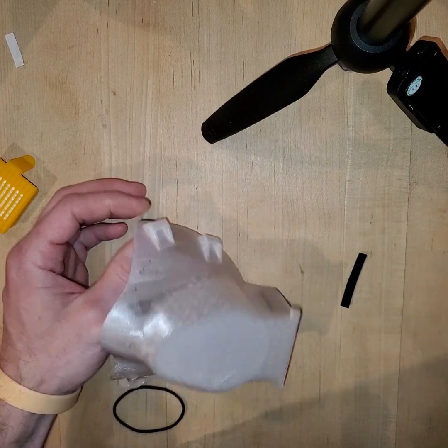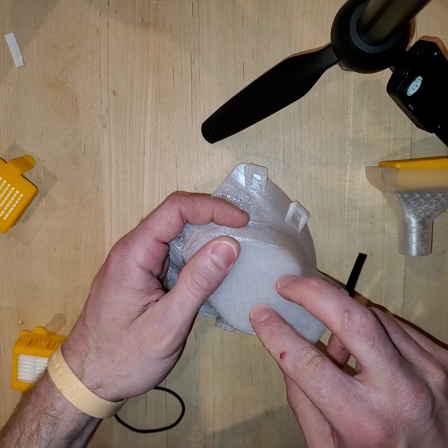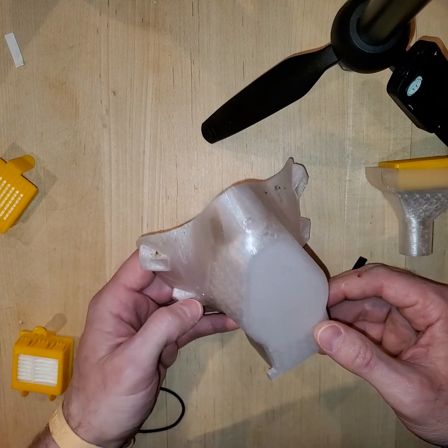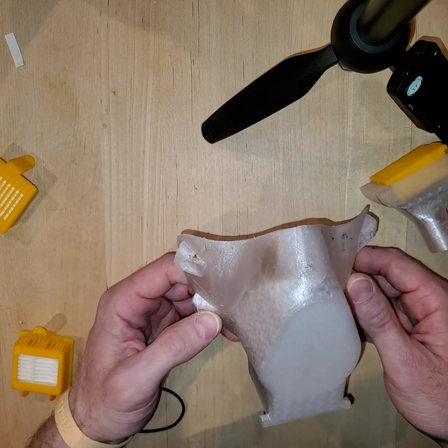Hopefully it helps. Let me know if you have any questions. Again, this is an active development thing. I'm going to be changing it probably with time, but for the most part, it checks all the boxes that I was really looking for.